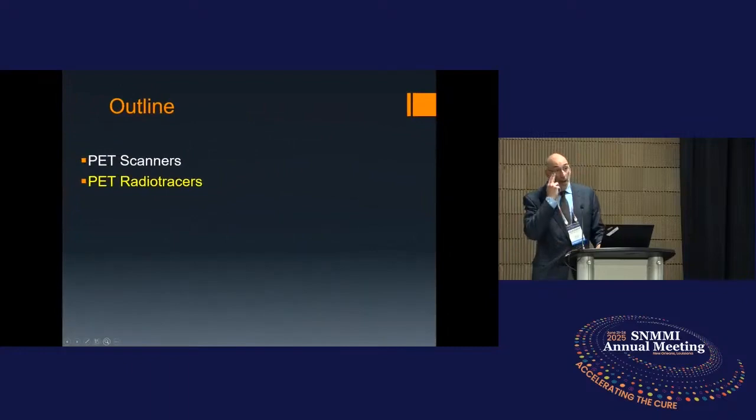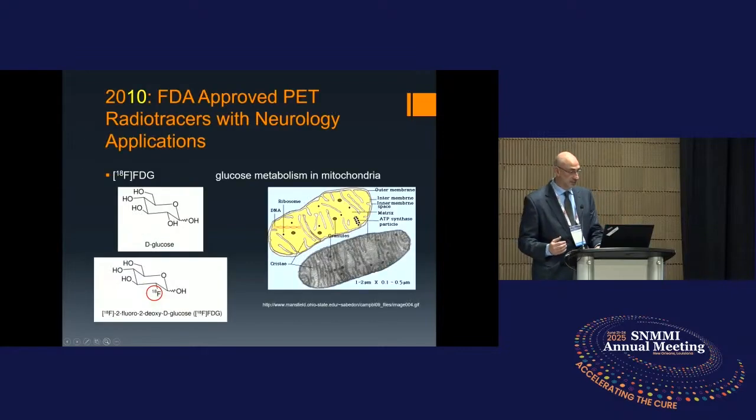And so we've talked about instruments. We've talked about how much better our scanning technology has been. But now we need tracers, right? You can't have a scanner and not have any radioactivity. The PET scanner is essentially a very fancy radiation detector where we're looking at how this radiotracer is distributed in your body.